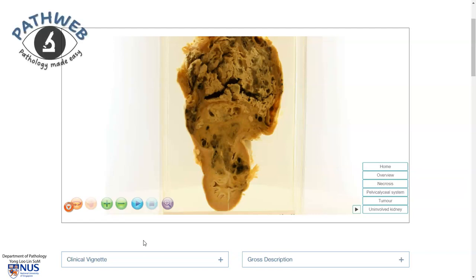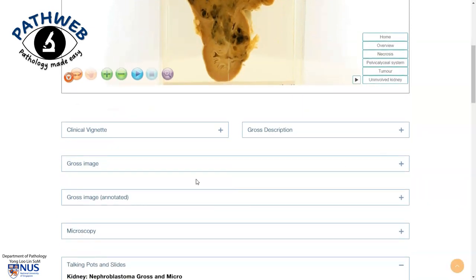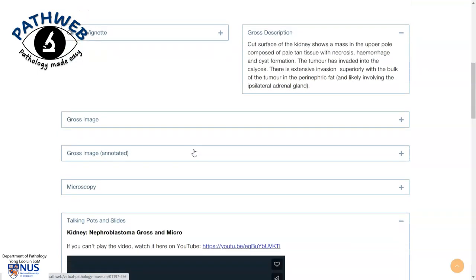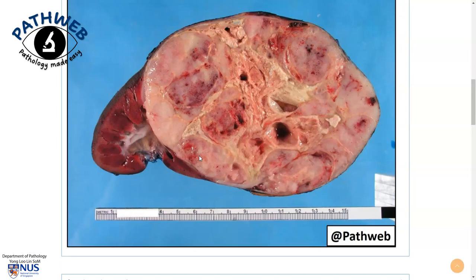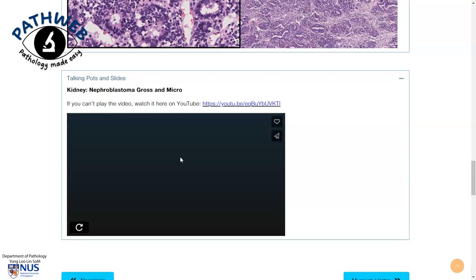This is taken from our virtual pathology museum in our online resource PathWeb. If you scroll down on this page, you will be able to see other bits of interesting information and also some examples of gross pictures, annotated microscopic pictures, as well as talking points and slides. If you would like free access to this online resource, the link is in the video description.